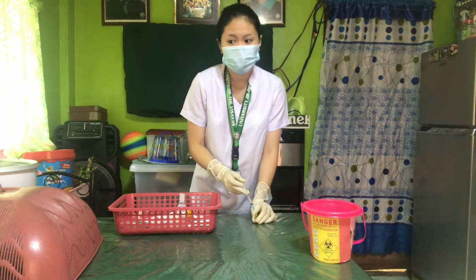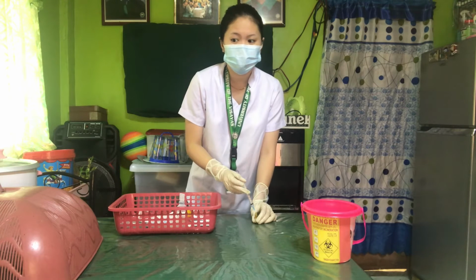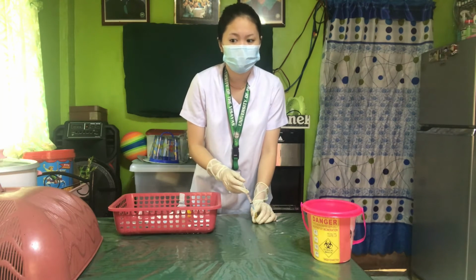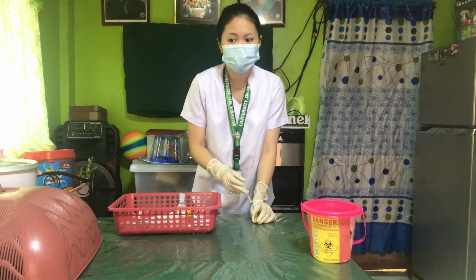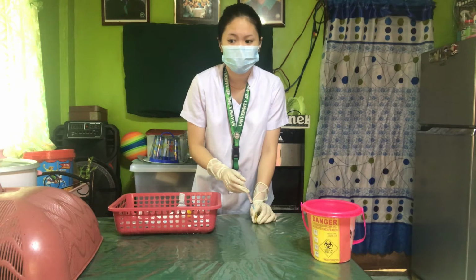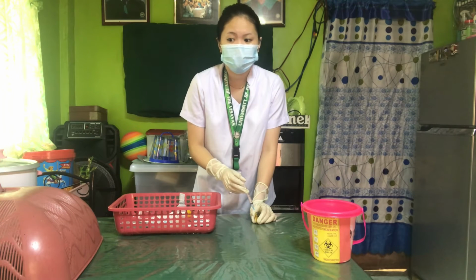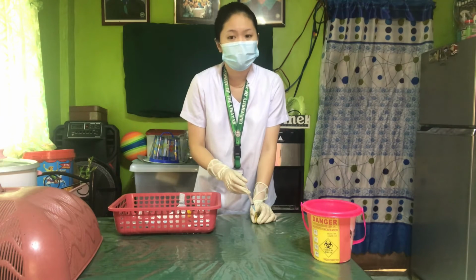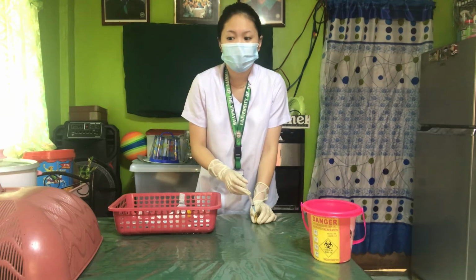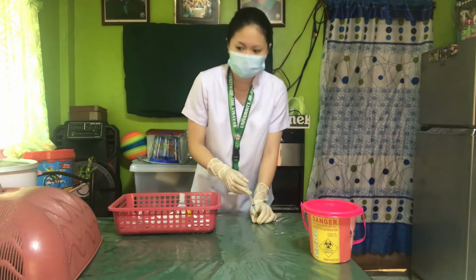So after we inserted the tuberculin syringe inside the ampule, we will now withdraw the amount of drug required for the dosage. This follows the 10 medication rights to prevent medication error. So assuming that the doctor ordered me to administer a 1 ml medication to my patient, now I will withdraw a 1 ml medication.